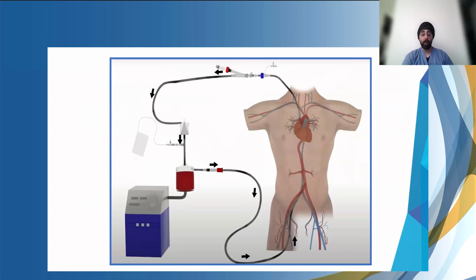Yeah, that is, I think, one of the downfalls of the AngioVac. If you want to go into the lungs, I don't think it performs quite as well there because the flows are just a little bit too much for the pulmonary circulation. So I will tend to switch to another device if I'm going into the lungs. I don't know what your guys' thoughts are.